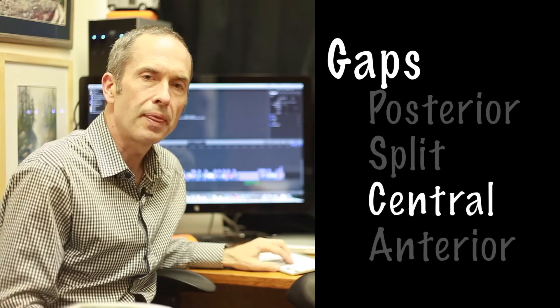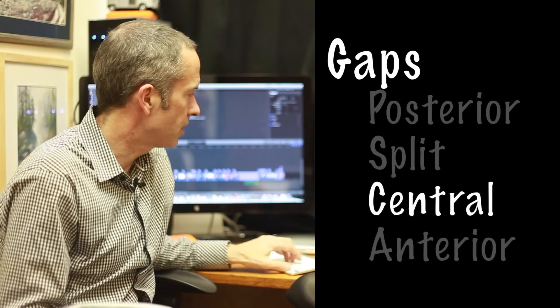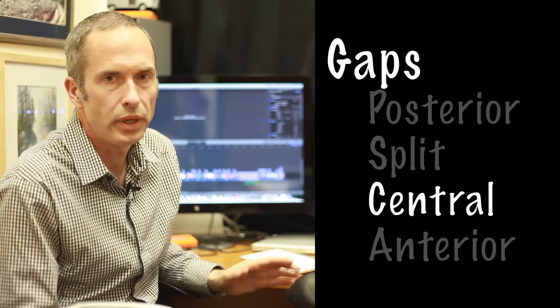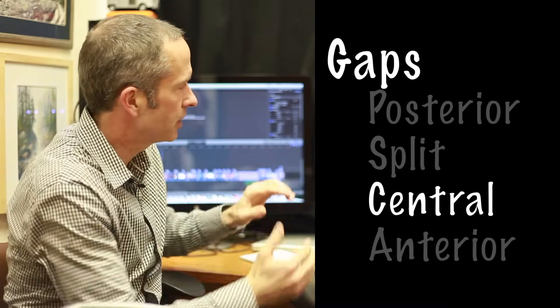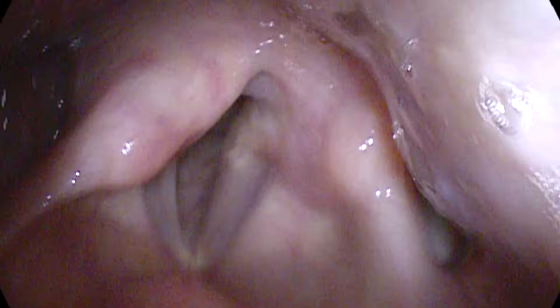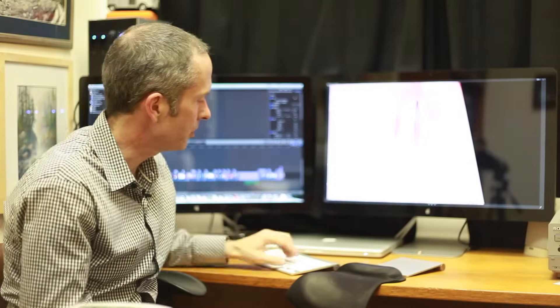Central gaps occur when there is some sort of weakness, so if the vocal cords are bowed or thin and they don't come together all the way. We're looking at the black hole in the middle — this person has a paralyzed left cord and we see the air leaking out. Anytime we can see black during a whole cycle, we're getting air leak, and in this case it's from the center.